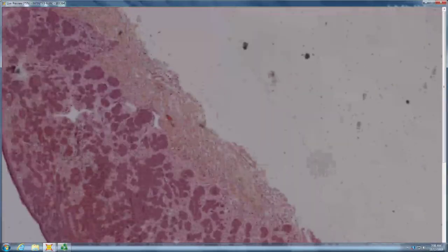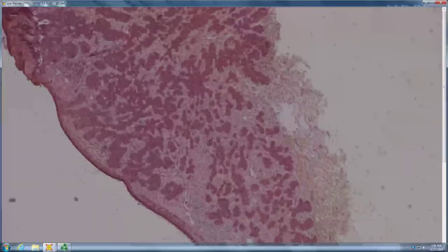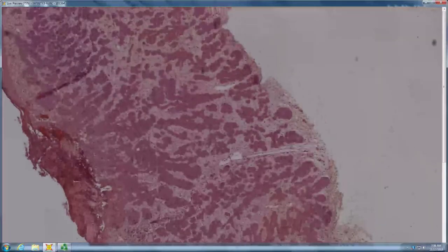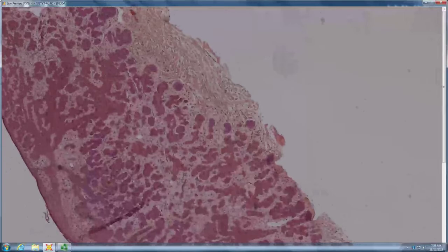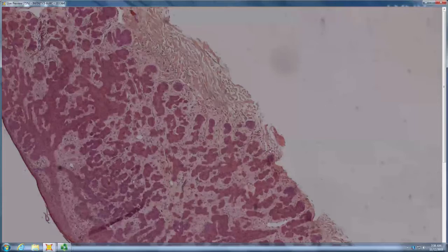It's like basal cells. What kind? Infundibulocystic. Yep. So this is all pink strands in search of their blue buds, right? And yet it's still going to behave like a basal cell. So basal cells are blue, except when they're red, and the red one is infundibulocystic. Pink strands, blue buds, horn cysts. This one is recognizable even though the blue buds and horn cysts aren't there. So, well done.